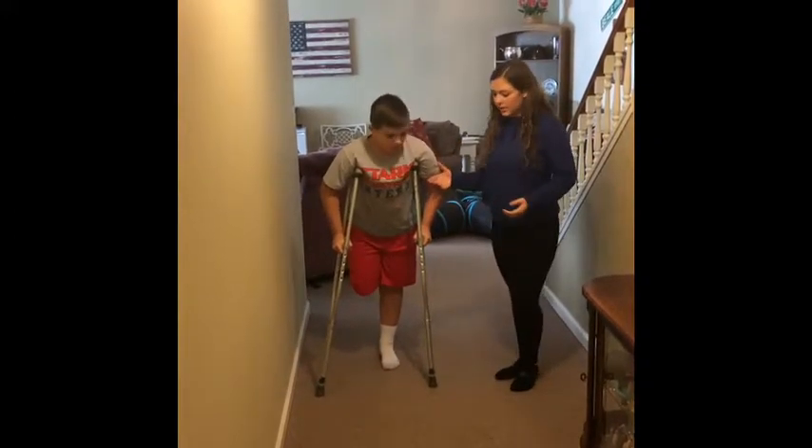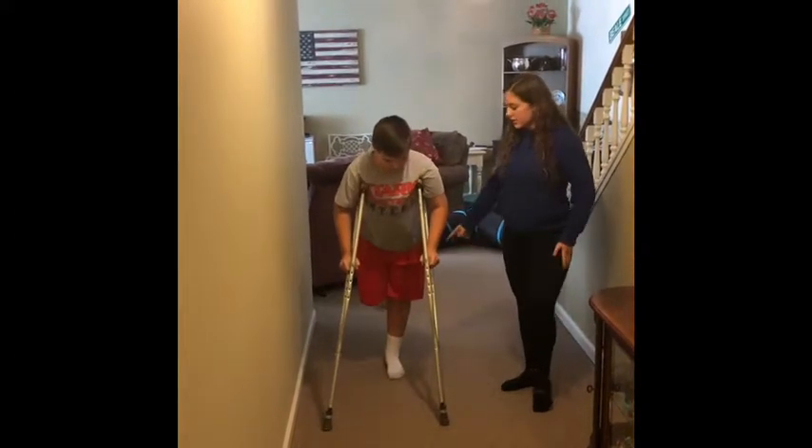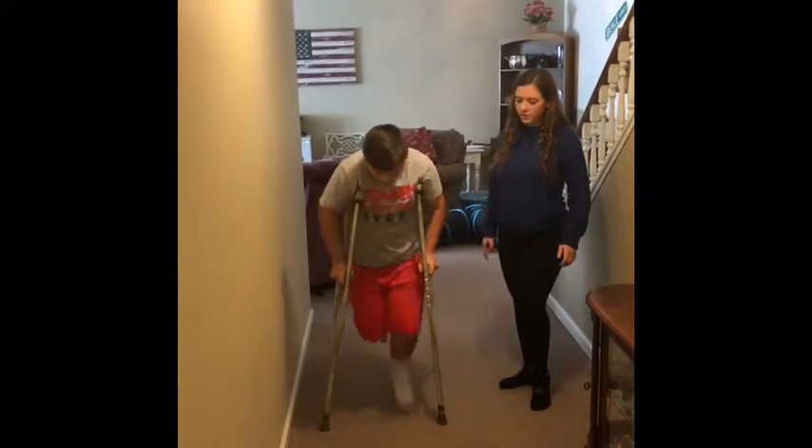Using the tripod method, the athlete will put the crutches 12 inches in front and use the non-injured leg to swing through and land.